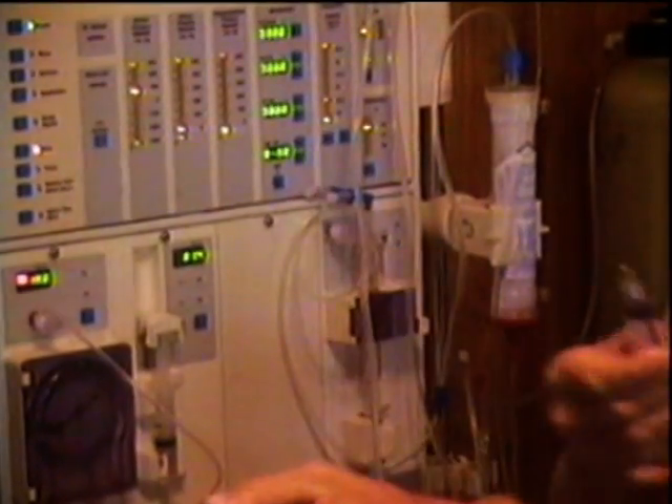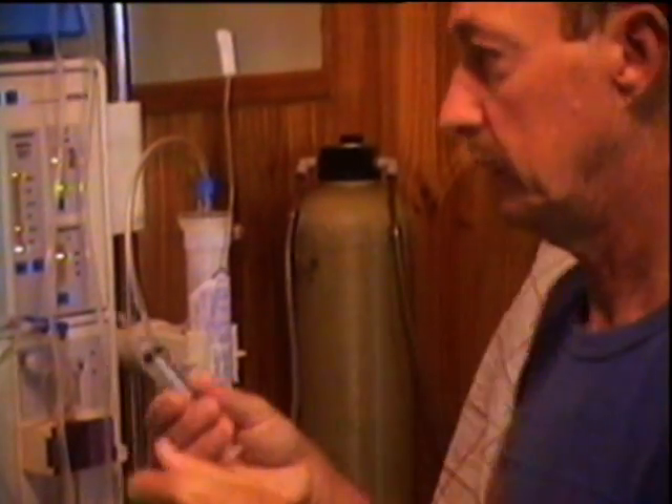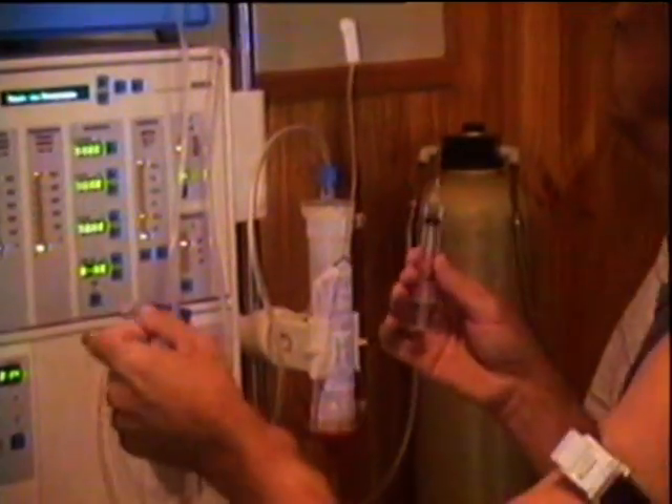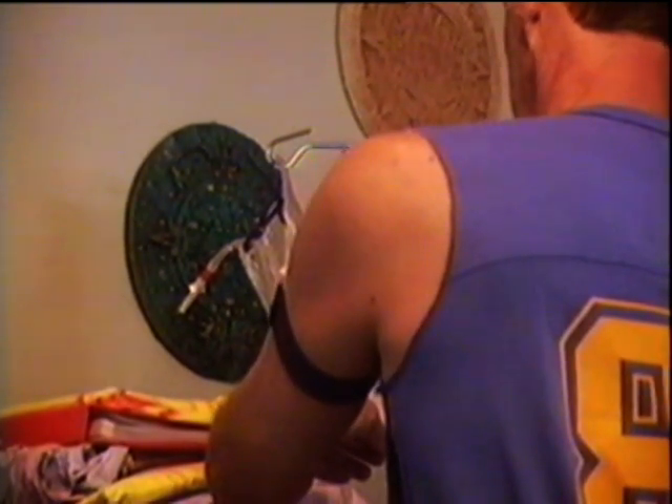This is for flushing these lines when you actually inject them into your arm. I'll fill up the rest with saline, which I'll get from one of these bags. The saline bags have a special port where you can put in a needle and just suck out some saline.